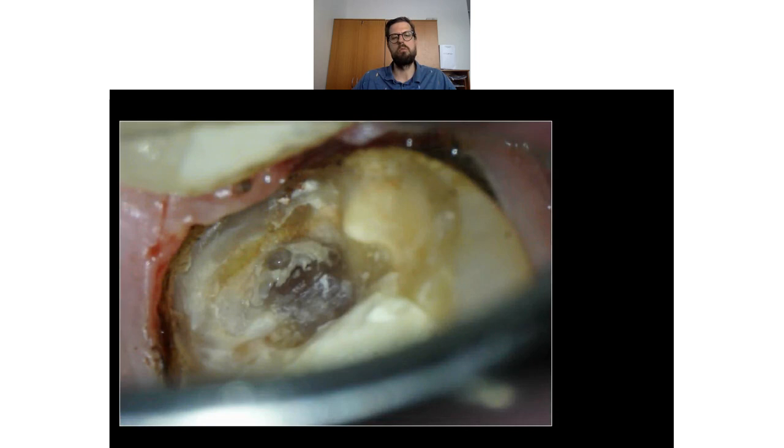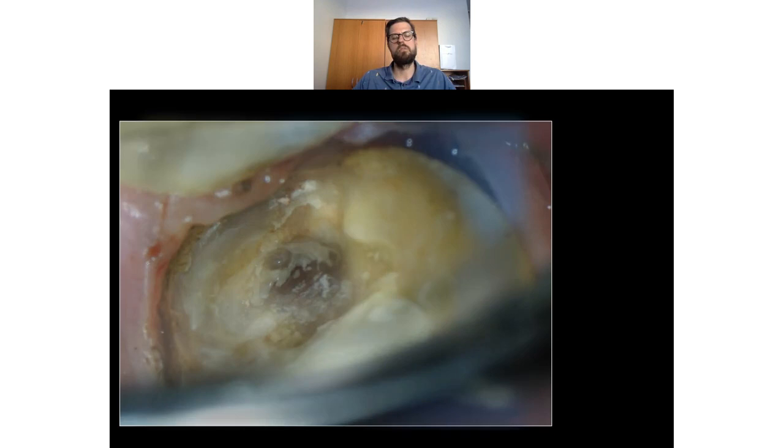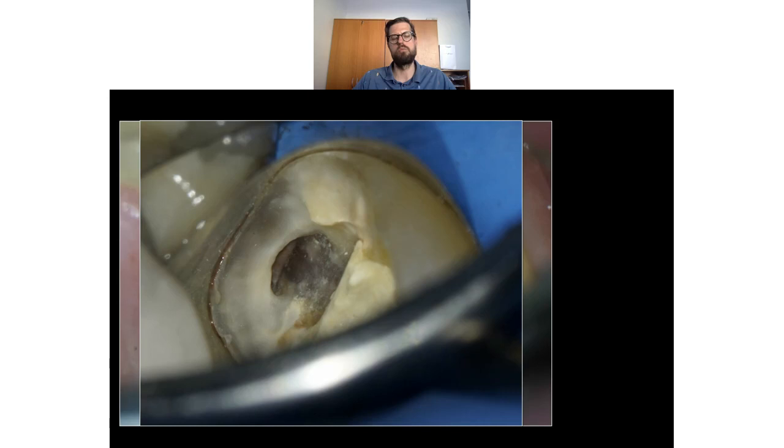So first, I cannot continue with the endo, even when I should find a mesiolingual, when there is moisture. So I must do the pre-endo now. I did my gingivectomy, and I managed to isolate the tooth and to put a matrix inside. As you see, there is moisture in the cervical area, and now is the point that you must remember.